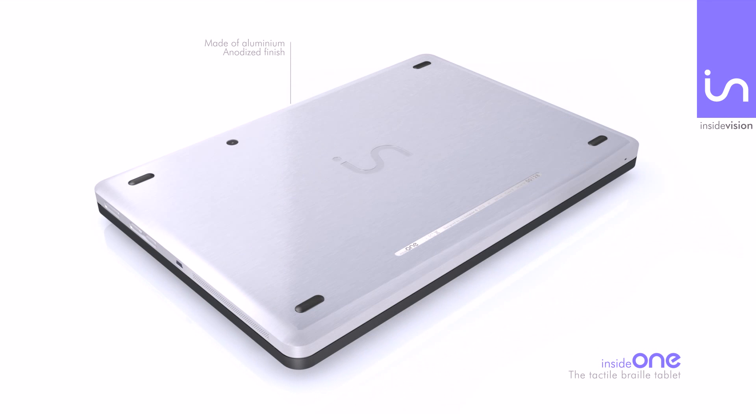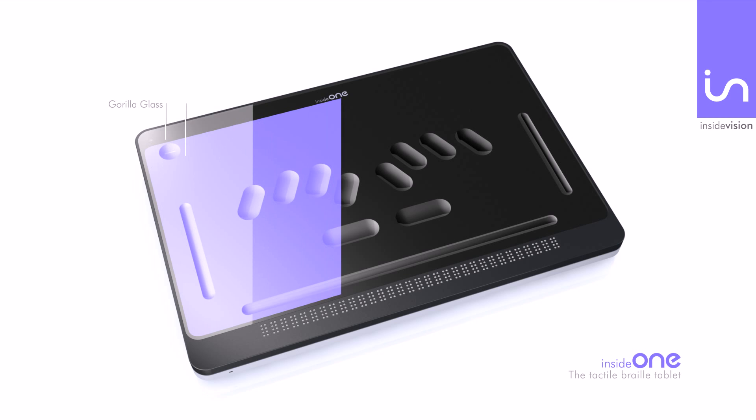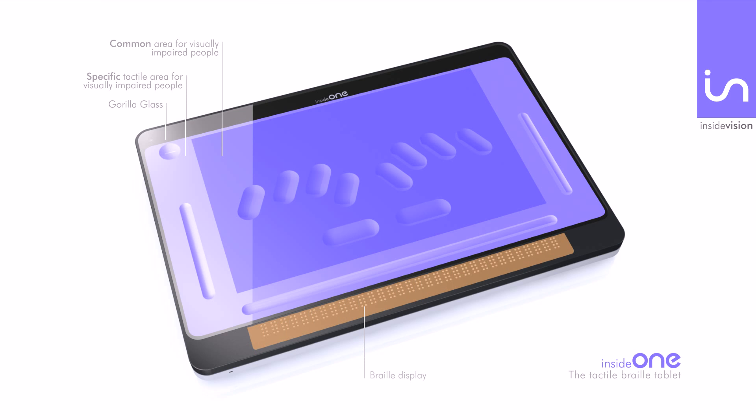InsideOne is made of high-grade anodized aluminum. The upper face is made of Gorilla Glass, including on its perimeter a specific tactile area for visually impaired people, and a tactile area equal to the 10-inch display of the tablet, on which the braille keyboard is indented. The 32 braille cells display is located on the lower border of InsideOne.